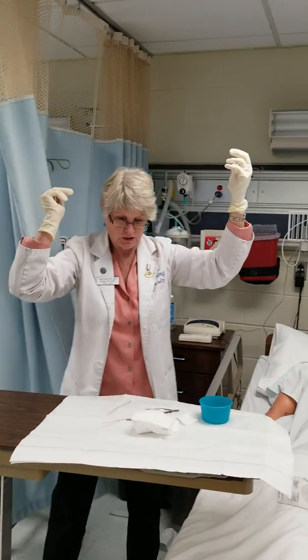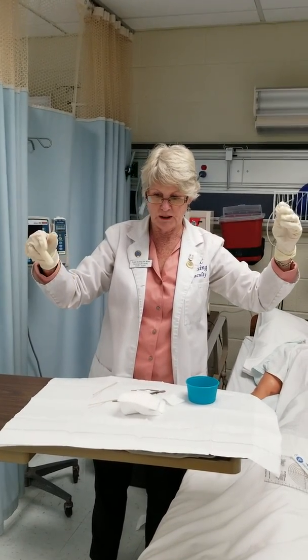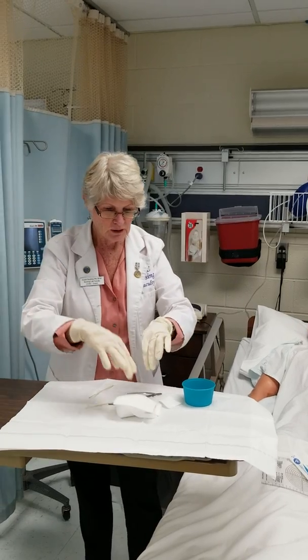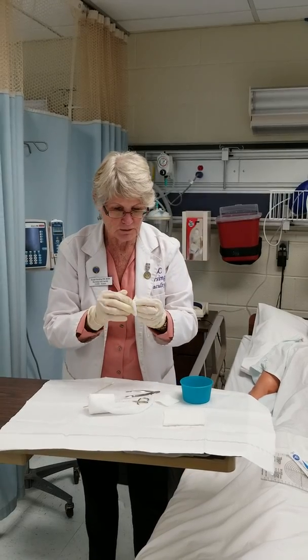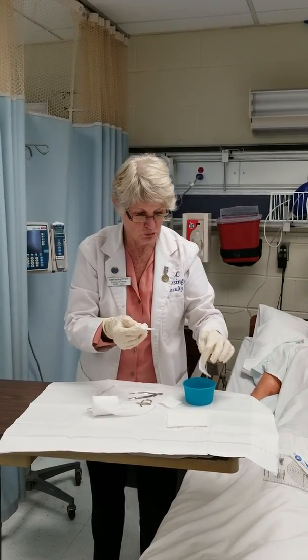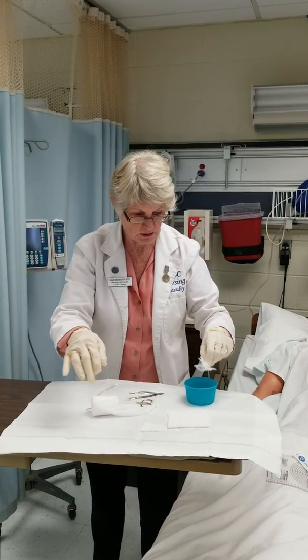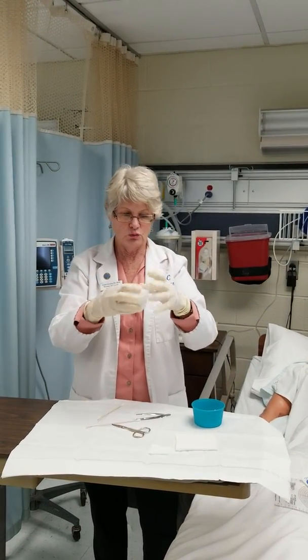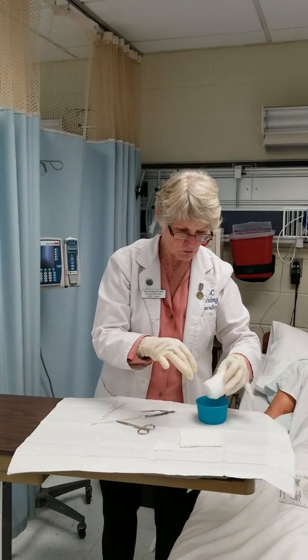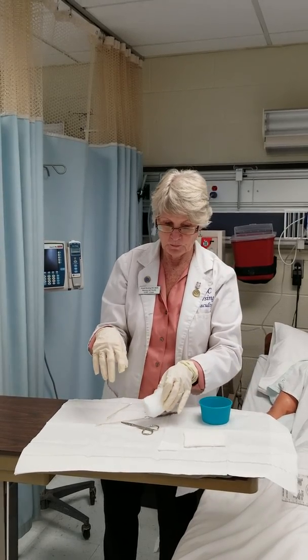Okay. I would just get rid of that so that there's no chance of it rolling onto my drape and contaminating. I'll now get my supplies in the correct order that I'll need them, and I'll need my 2x2s, and these I use to clean the wound. So 1, 2, 3. I only need 3, so I can set 1 extra there. And then I need my sterile gauze, and this too will go into my water. So I'll pop that in the water, and I use that to clean the wound. Okay. This concludes setting up a sterile field.